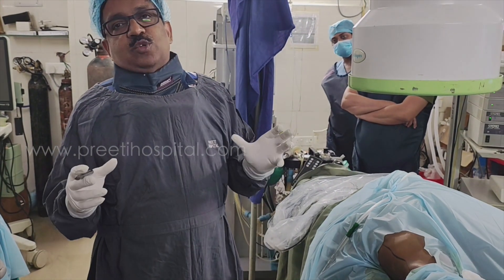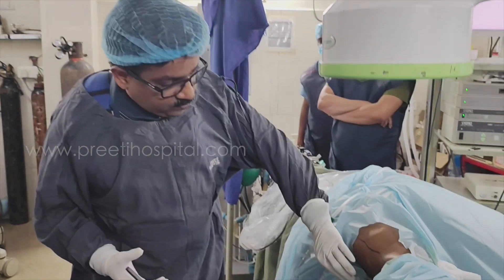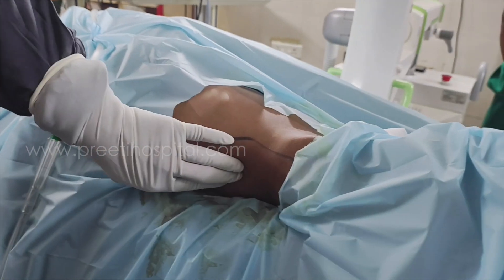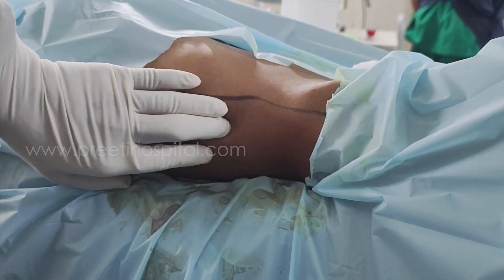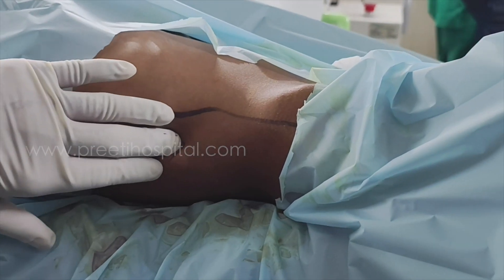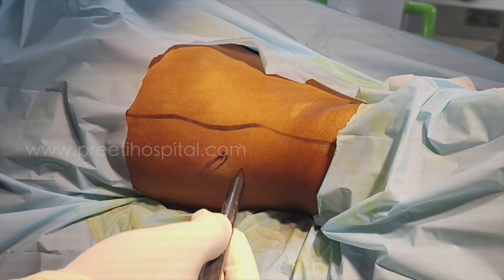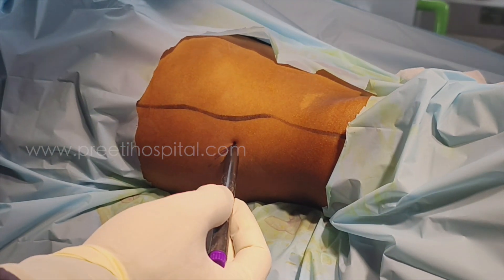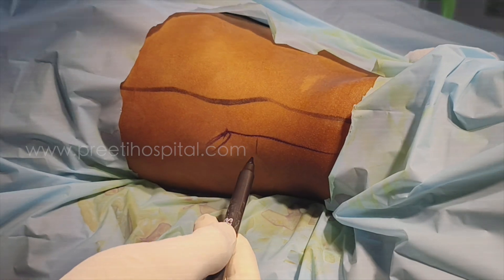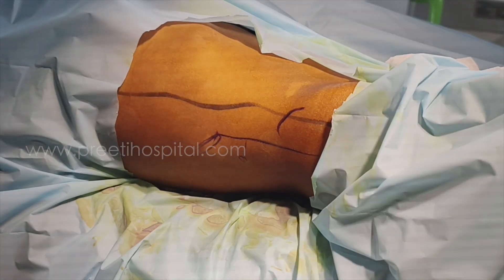Many people ask: can you teach supine PCNL and prone PCNL? This is what we have to learn. First, feel the rib — you come from below and feel the rib tip. It is here — very big rib, very nice rib. So, the basic entry point should be below the 12th rib tip, and posterior to the 12th rib tip a little — in between the iliac crest and the spine.